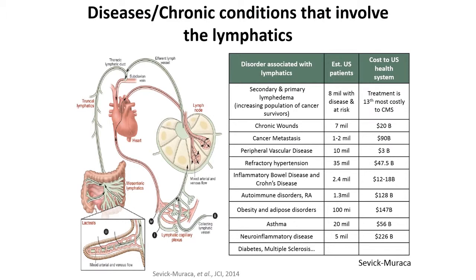So what's interesting about this is that for the first time, I think we're looking at longitudinal changes, and that we can actually ameliorate this dermal backflow that we have used in the past to characterize the initial onset of lymphedema. And so perhaps now we're able to manipulate the lymphatics so that we can relieve the symptoms associated with these very chronic conditions.